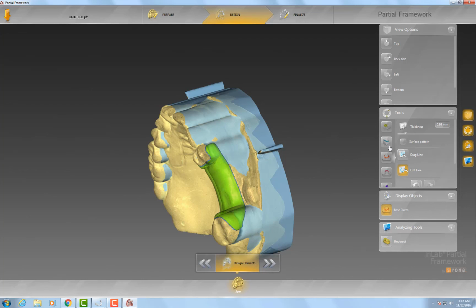Plus, when doctors see a clear base plate, they're like, ooh, what is this? It's new technology. So then they get calling, hey, what is this? What are you doing? And you get your chance to show the doctor that you're not just some person in the garage or some person in a lab. You're a technician that knows what he's talking about, and they really listen and pay attention to those people who are really adapting new technology.